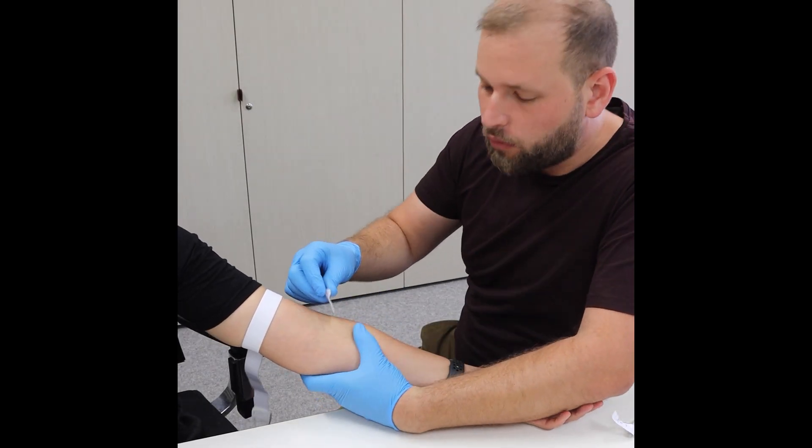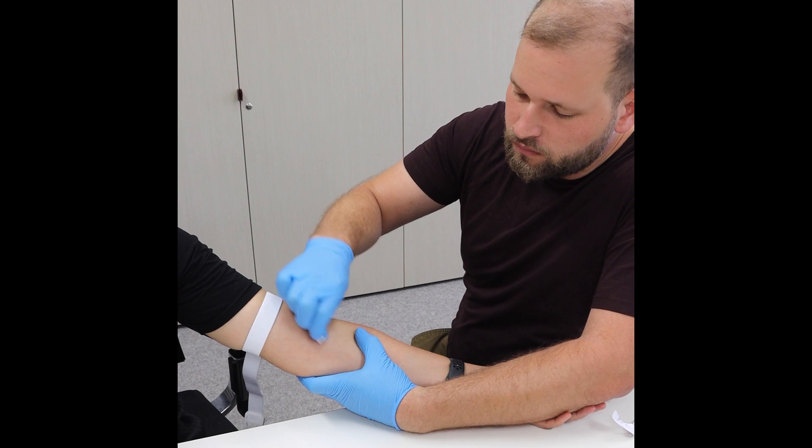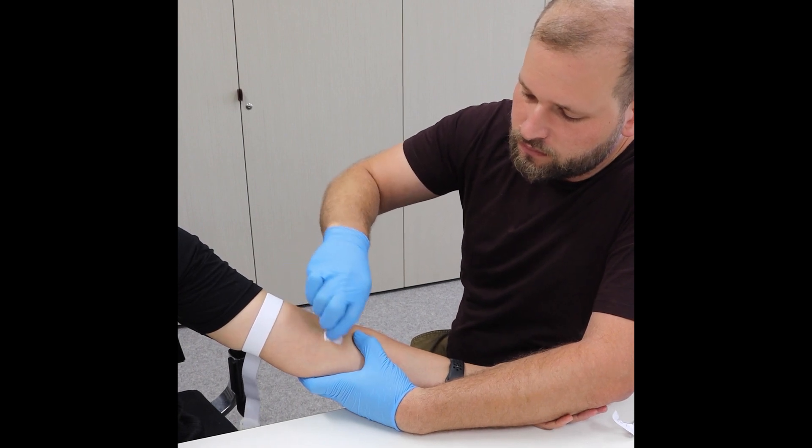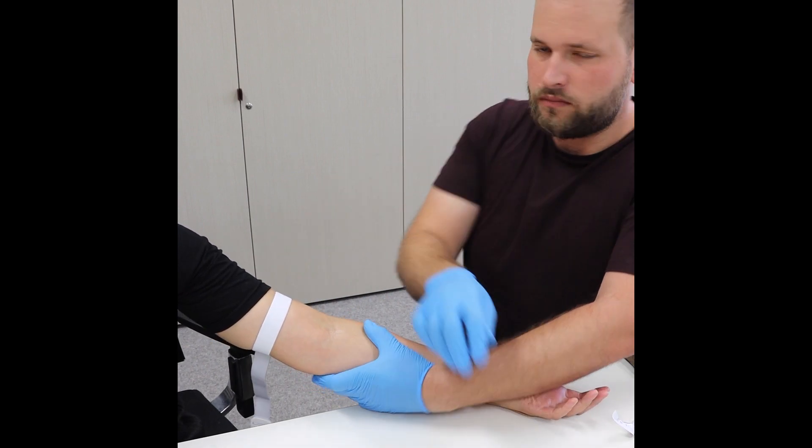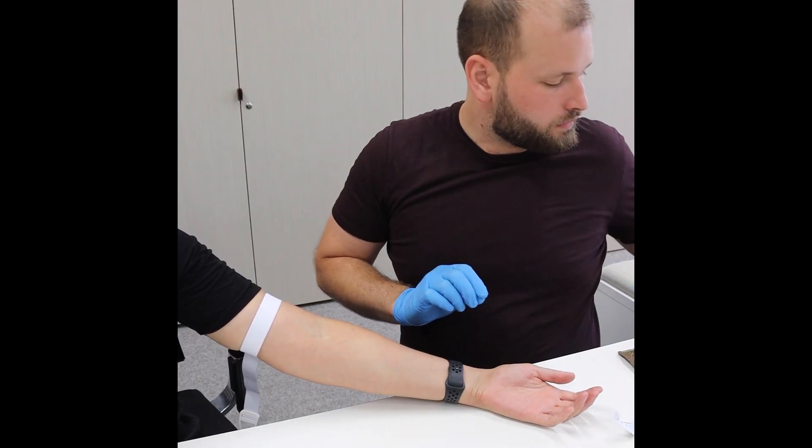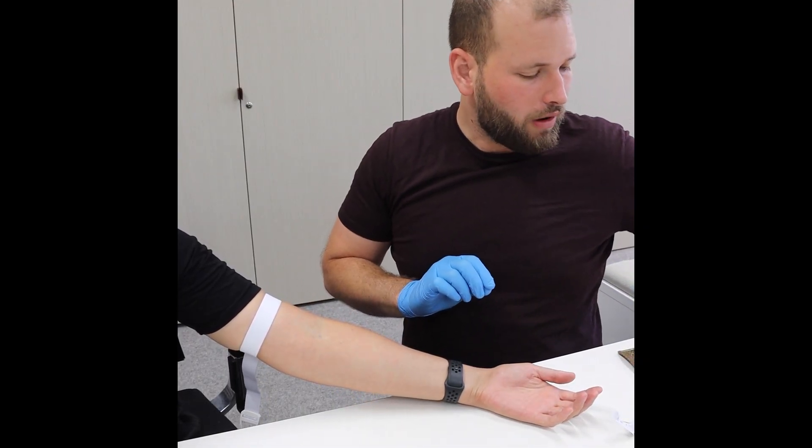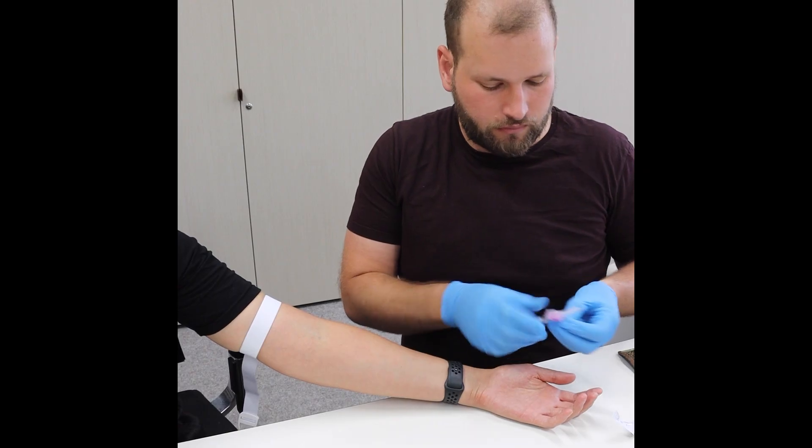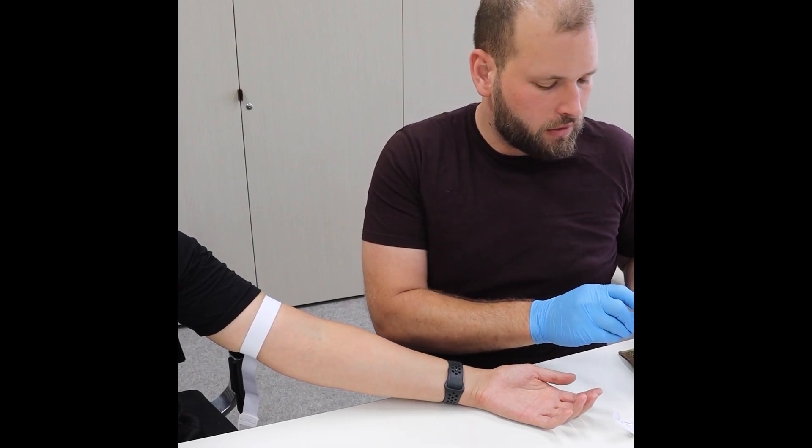So we've got our awesome model here. Got my 20 gauge.